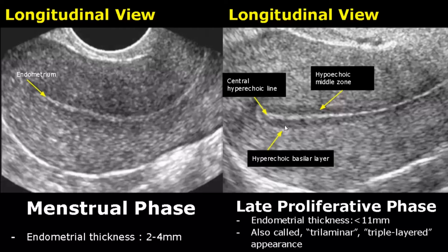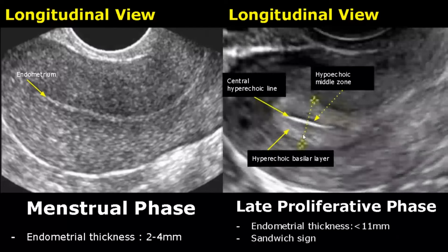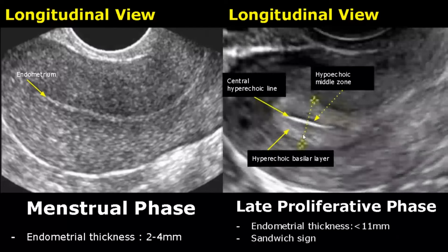In the late proliferative phase, the thickness can be up to 11 mm and we have three distinct layers: the innermost central hyperechoic line, followed by a hypoechoic middle zone, and the outermost hyperechoic basilar layer. This appearance is known as trilaminar or triple-layered, and is also called the sandwich sign.